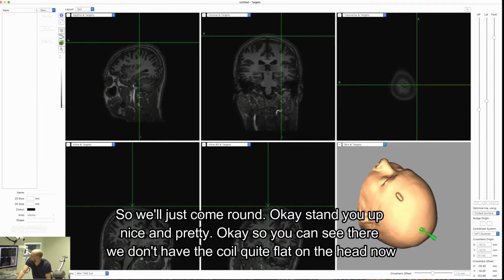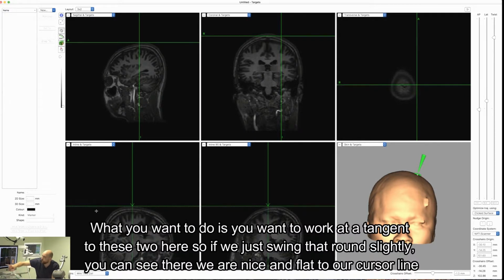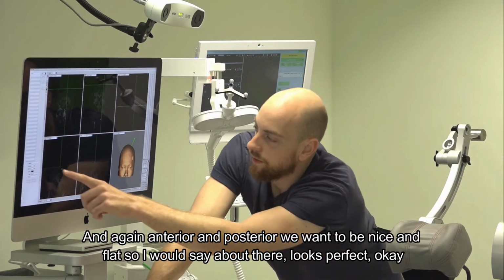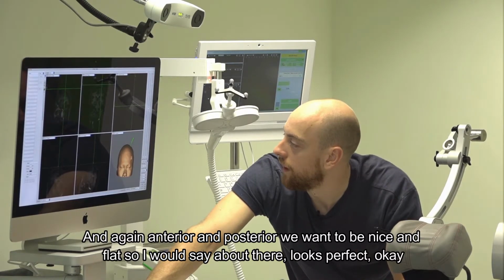So I'll just come round. Okay, we'll stand you up nice and pretty. We can see there we don't have the coil quite flat on the head. Now what you want to do is work at a tangent to these two here. So if we just swing that round slightly, you can see there we are nice and flat to our cursor line. And again, anterior and posterior, we want to be nice and flat. So I would say about there.